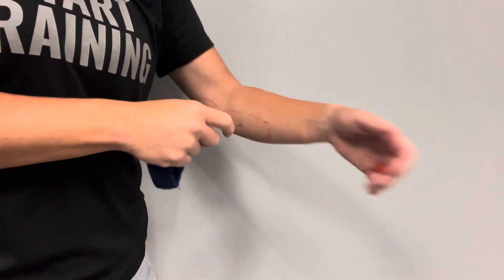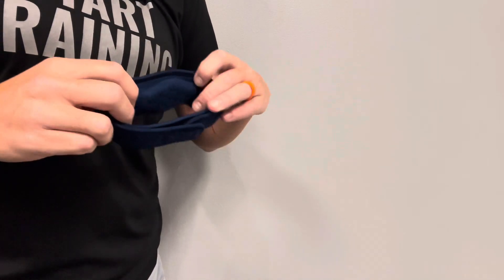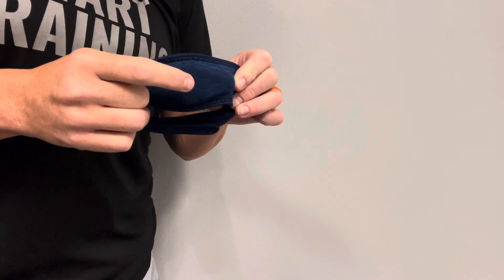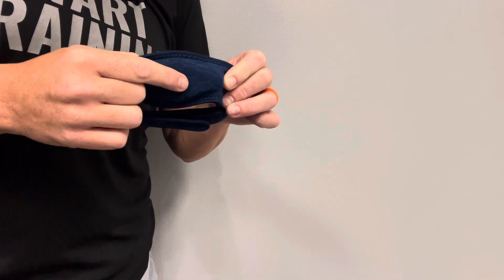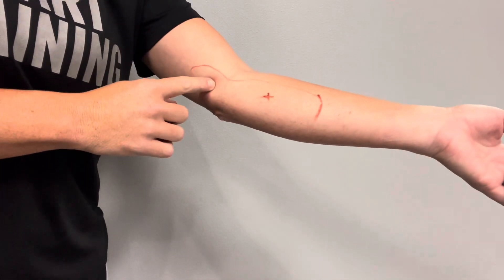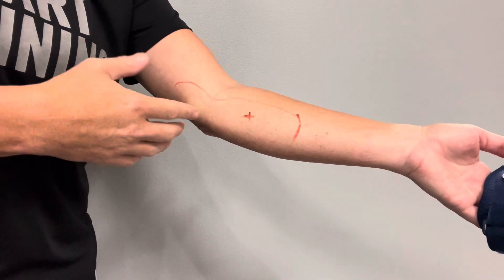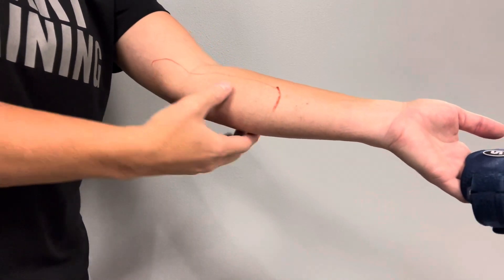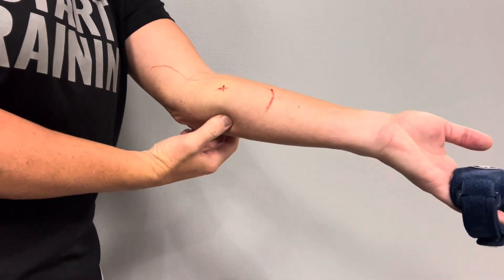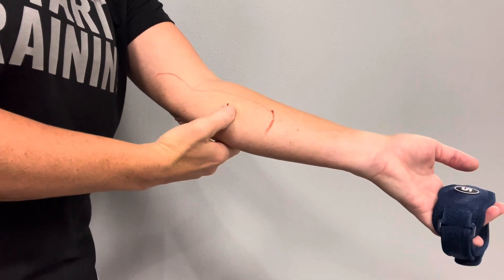When we apply the elbow support brace we want to make sure we find where to put it. On the inside of the main piece you'll notice there is a foam pad. We want to make sure that foam pad is placed directly on the most sensitive part of the muscle. Even though you may have pain up here, we don't want to put the brace up there — that will impede movement. So we're going to go into the muscle belly below the joint and poke around a little bit to find the most sensitive spot. Mine's right about there.